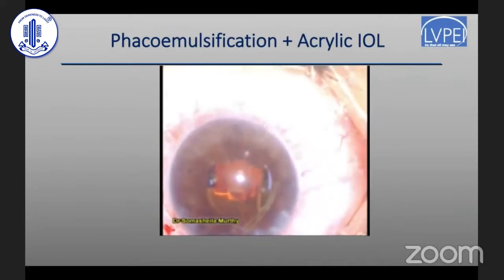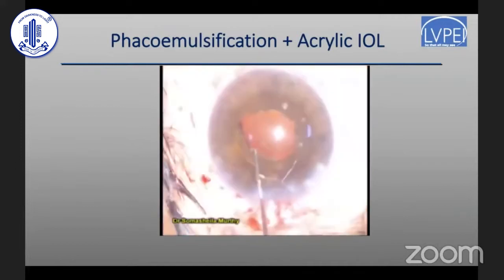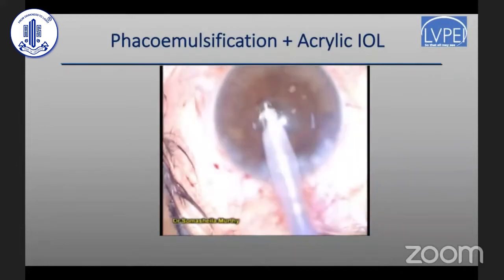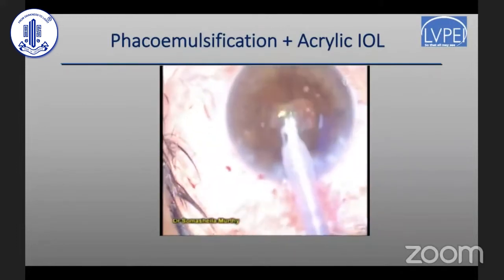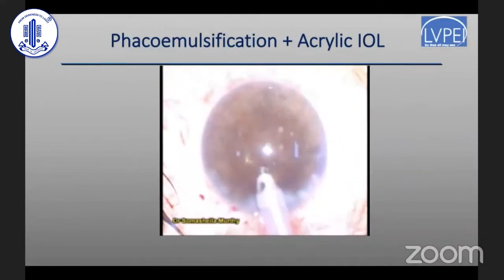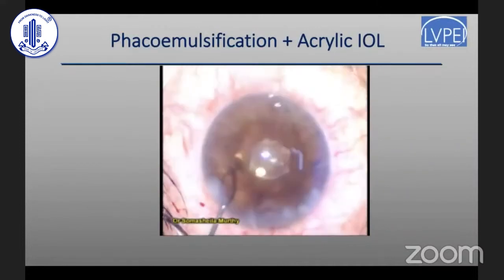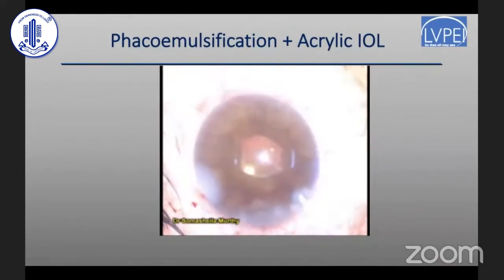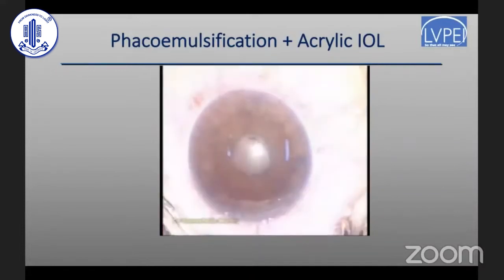As you can see, it's a case with a very heightened red glow due to VKH — a sunset glow. A single-piece hydrophobic acrylic lens is placed in the bag, making sure the optic and haptics are well tucked behind the rhexis. At the end of surgery, after cleaning up all the viscoelastic, I give either an intracameral Decadron injection, or in some cases a posterior sub-Tenon's or intravitreal triamcinolone injection — but only in patients confirmed to be non-steroid responders.